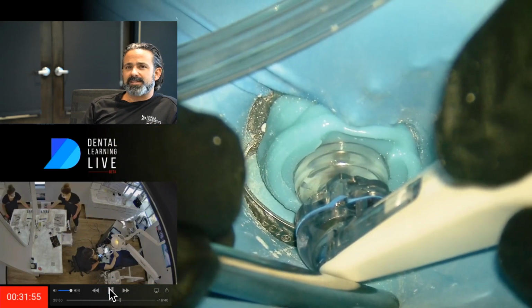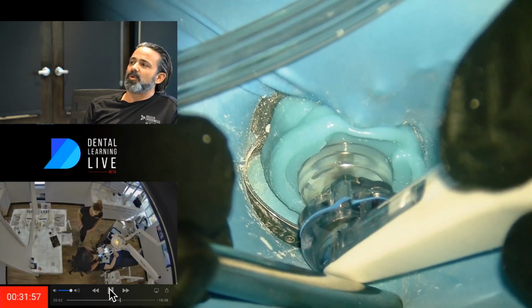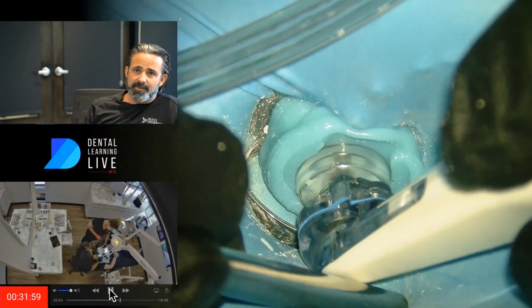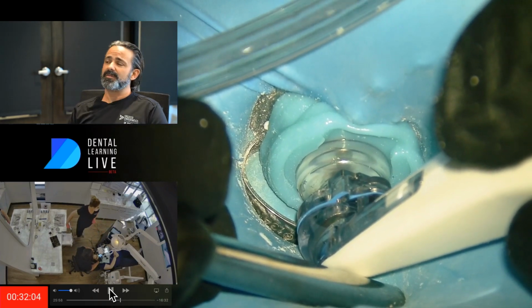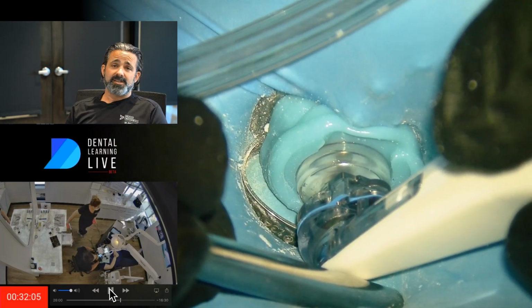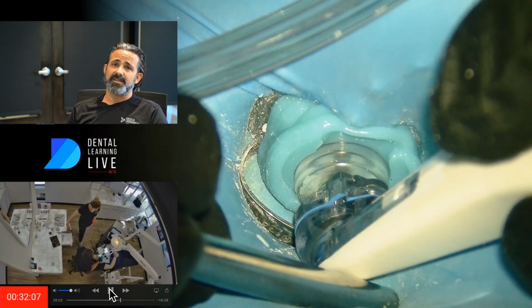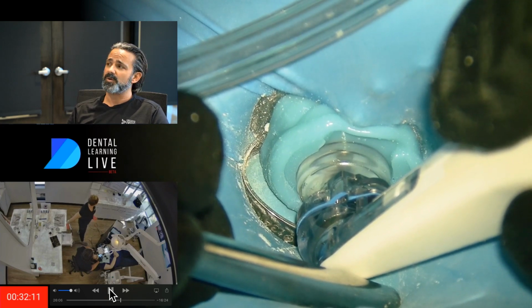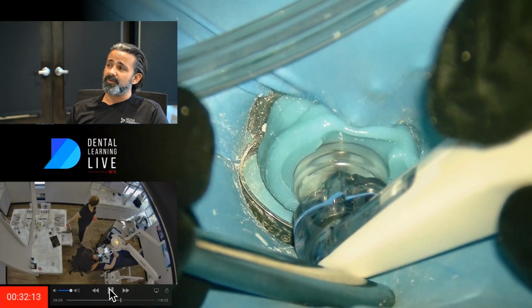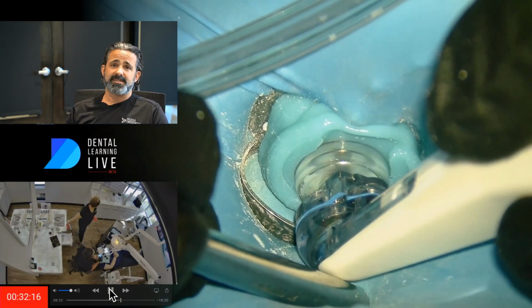People ask how they developed the protocols for the timing of these things. In some discussions that I've had with them, they do SEM studies on all these teeth that they test in the lab, and from that they've developed timing protocols. And so roughly for the retreatment, it's the same as the extended cycle.